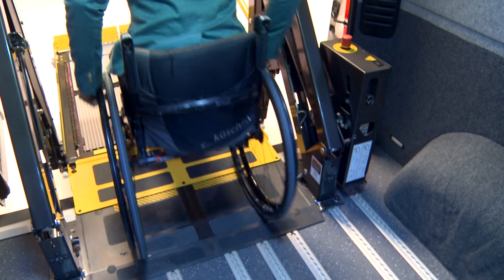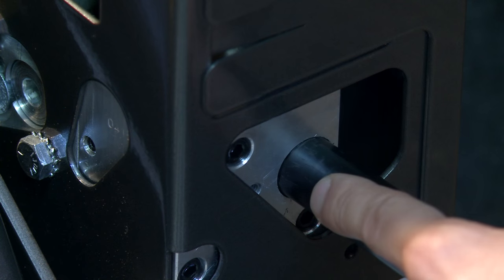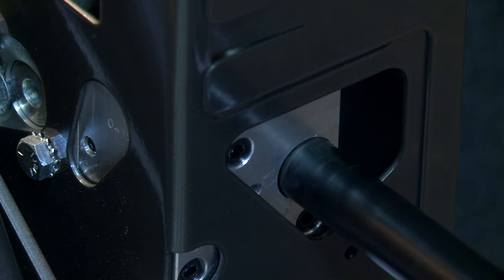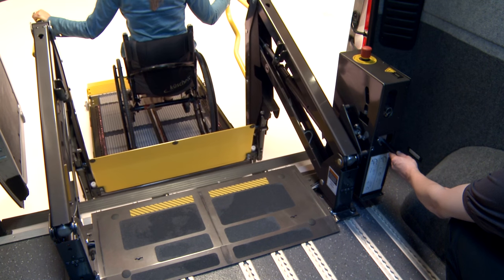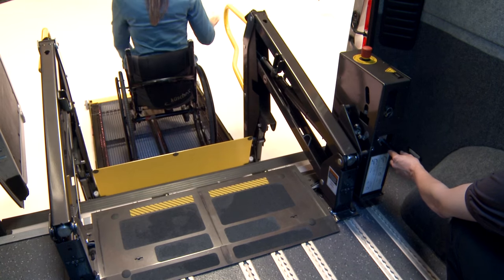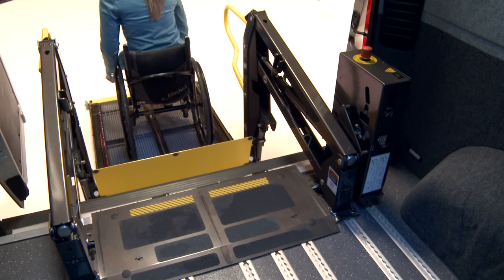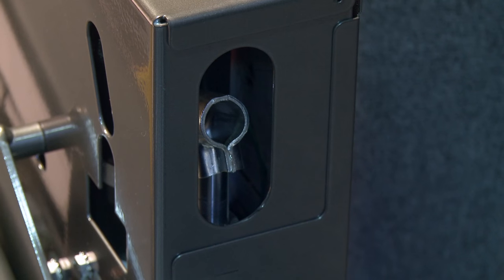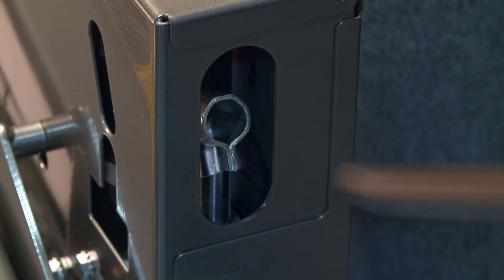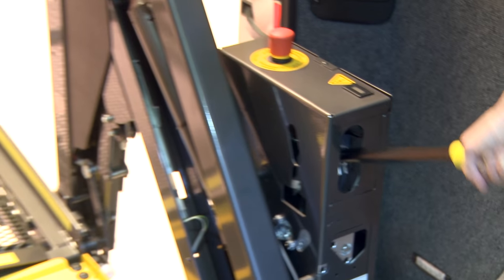Load the wheelchair user onto the platform. Fit the handle into the power pack valve and turn gently anti-clockwise for a quarter of a turn to allow the platform to lower to ground level. Turn the handle clockwise until tight. Unload the wheelchair user. To lift the platform back into the vehicle, put the handle into the pumping position, then pump until the platform is fully folded.